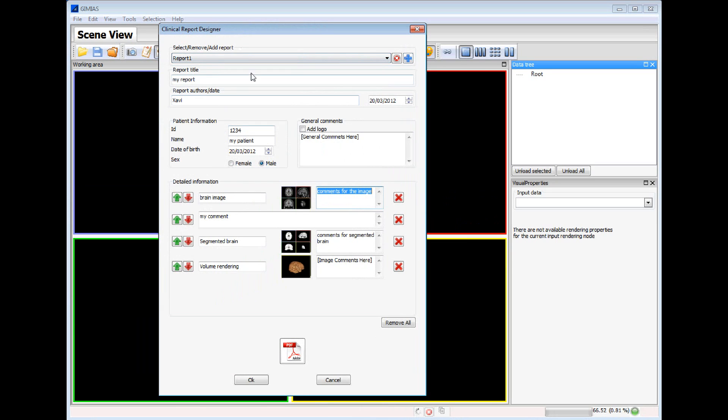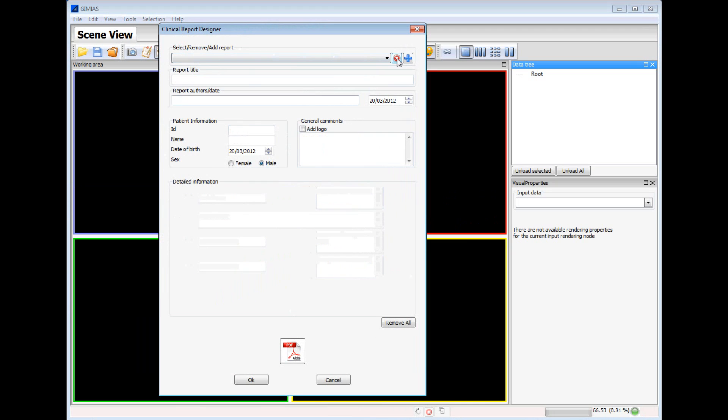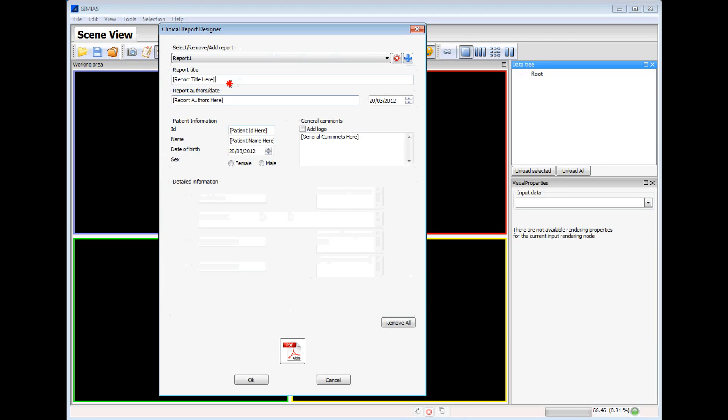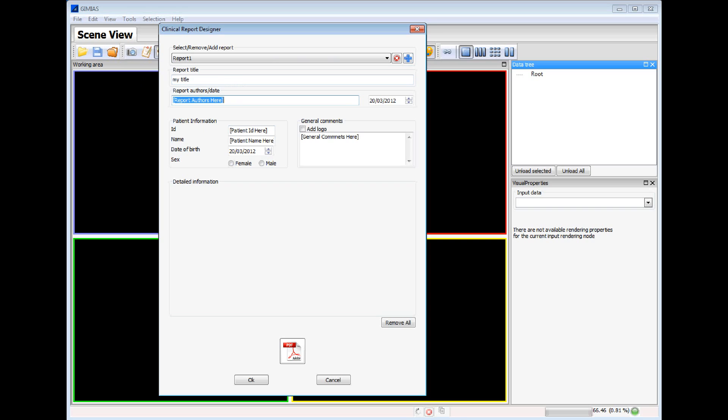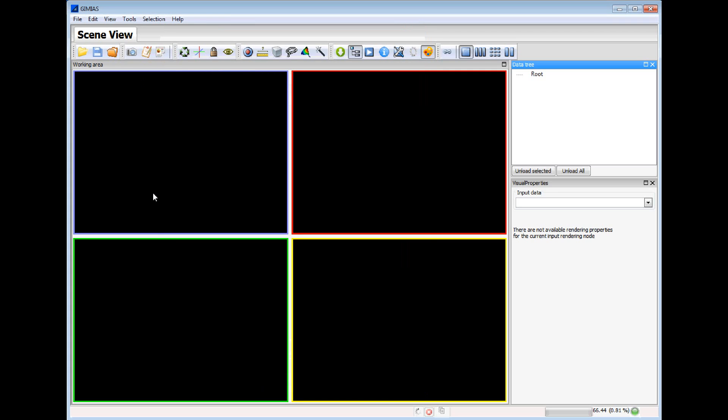Here we can see that there is already one created so we remove it. We create a new one, we put the title, the author and the information of the patient, the ID and the name. We select the sex and we click OK.